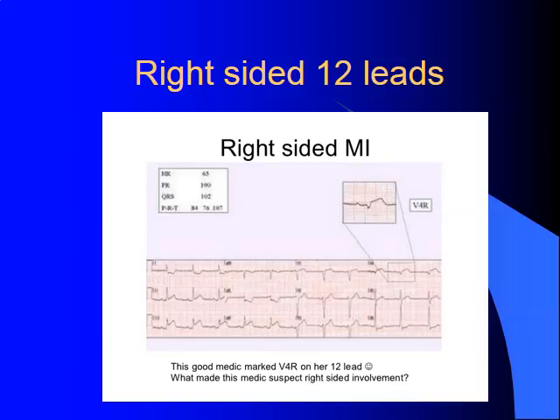All right, something that I may have touched on a little bit, but I want to drive this home a little bit further. When talking about our EKGs, especially in relation to inferior STEMIs, we do need to be cognizant of the possibility of a right ventricular wall MI. What happens is, as we stated quite a while back, the coronary circulation can be different from patient to patient. They can have an inferior wall that is supplied by the left coronary artery, or they can have branching off into the LAD and then dropping down, and it's obviously a smaller circulation.